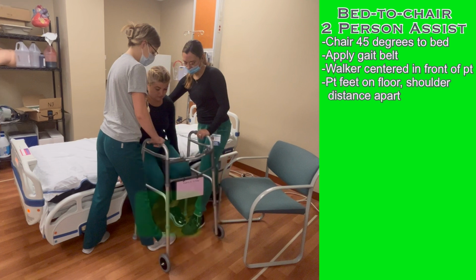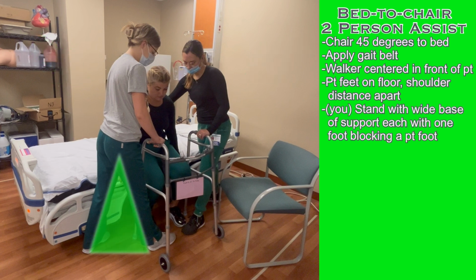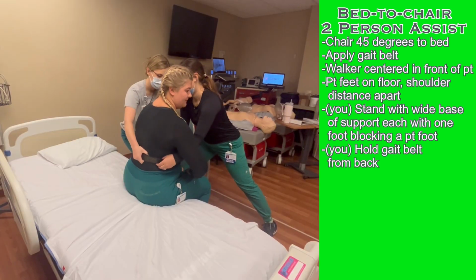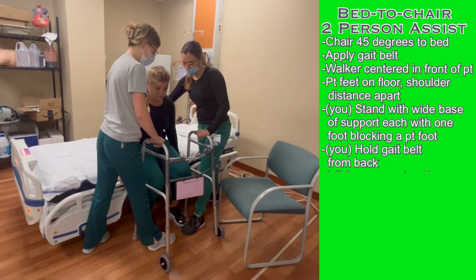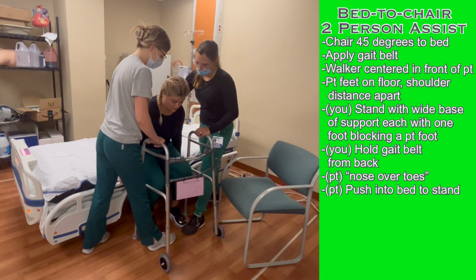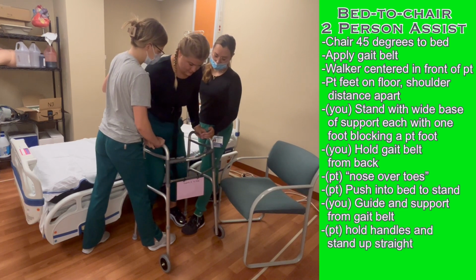Have the patient's feet shoulder distance apart and touching the floor. Have each healthcare worker stand to either side of the patient, with a wide base of support and with one foot in front of and blocking one of the patient's feet from sliding forward. Each of you should hold the gait belt from behind the patient's back. Have the patient lean forward until their nose is over their toes. Push into the bed and stand. You and your partner will assist the patient from the gait belt. Have the patient stand up straight.